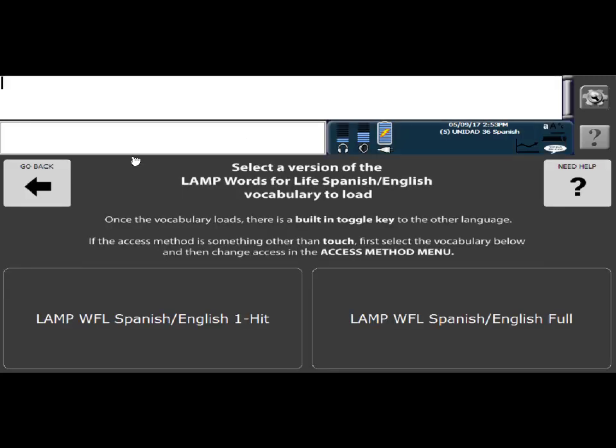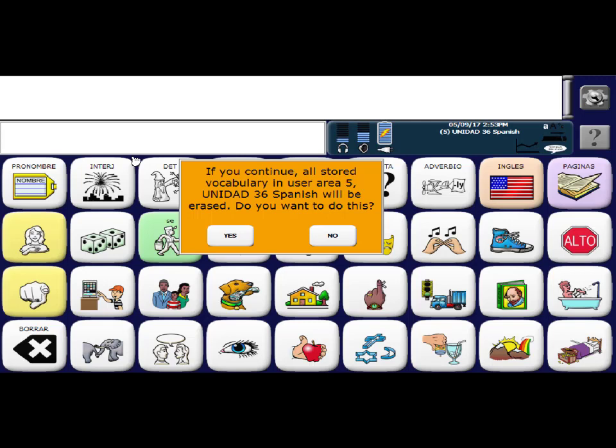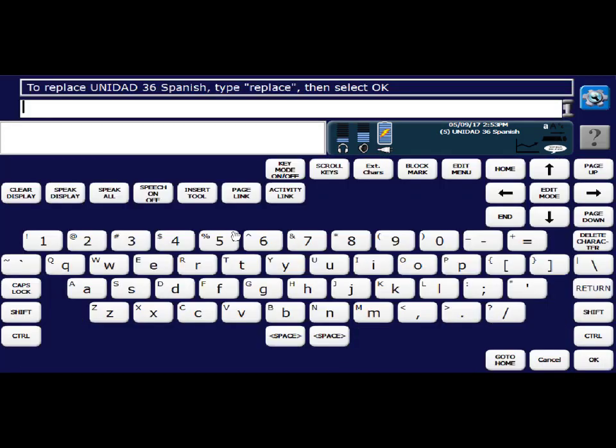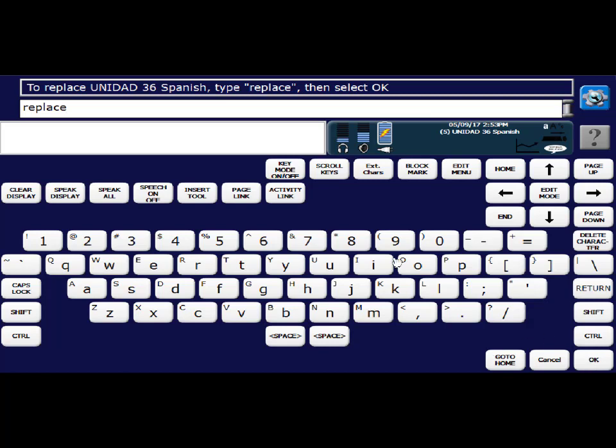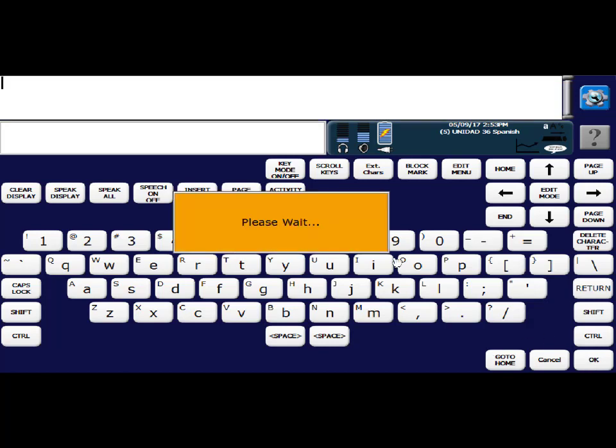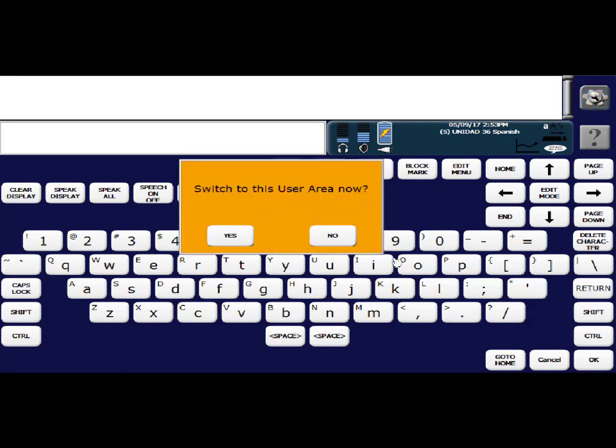Wait till the screen changes. It'll tell you, if you continue, all stored vocabulary in area five will be erased. Are we okay with this? I'm fine with that. I know I could always load it back in if I needed that UNIDAD 36 in Spanish. So I'm going to say yes, and then I'm going to type replace, say okay, and it'll ask you if you'd like to switch to that user area now, and I'll say yes.